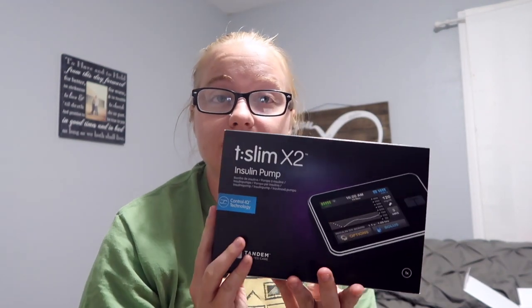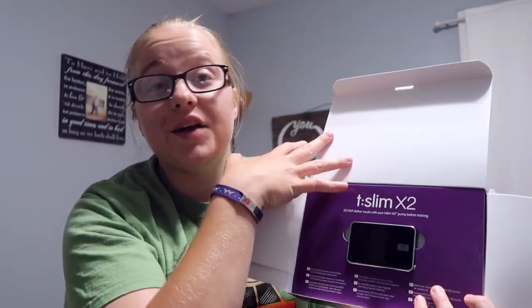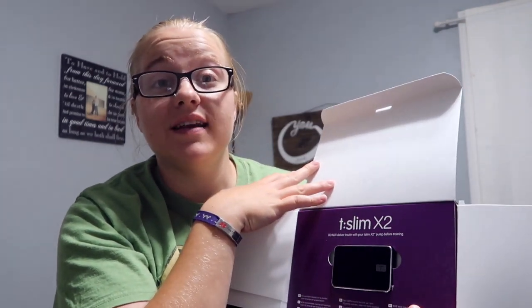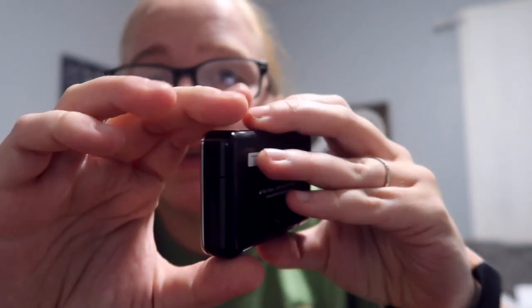Now, moving on to what you've been waiting for — the insulin pump itself. It came in a separate box all by itself. I really like how it is all packaged, and I paid enough for it to be super excited to open it. Here is the pump — it's very thin, and I'm really excited to put it on and start using it. It's going to make everything so much easier.